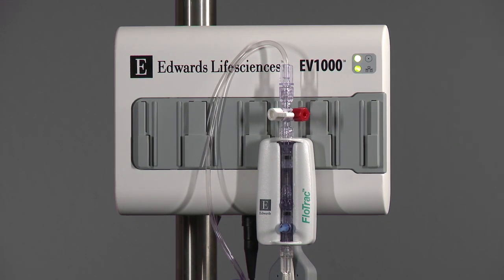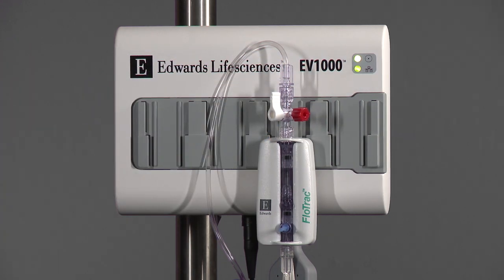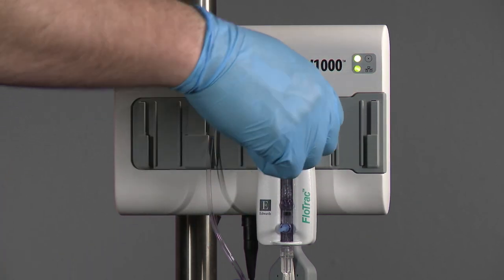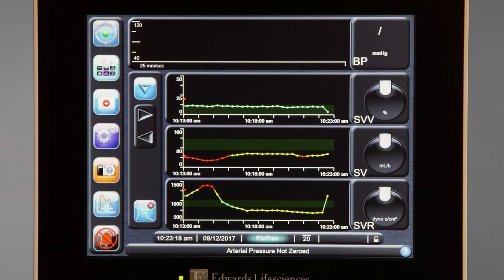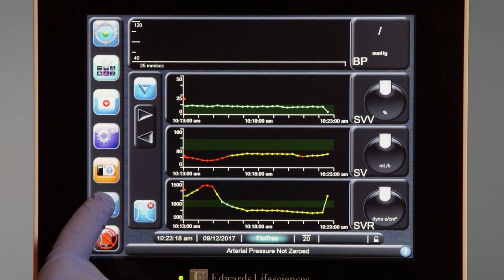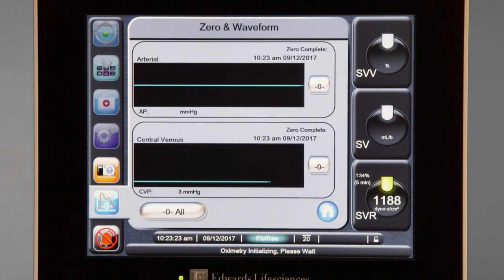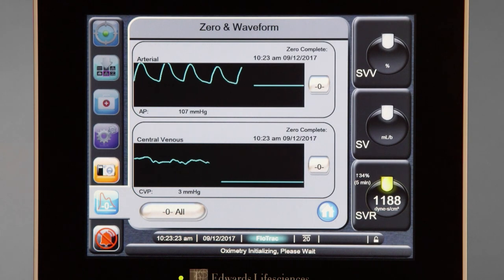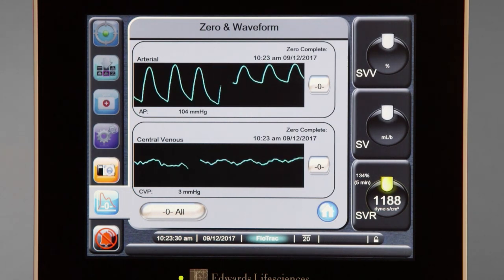Level the FlowTrack sensor to the patient's phlebostatic axis. Turn the reference stopcock of the FlowTrack sensor toward the pressure tubing and remove the non-vented cap. With the stopcock open to atmosphere, zero both the bedside monitor and the EV-1000 Clinical Platform. Confirm that the EV-1000 reads zero complete and the monitor reads zero millimeters mercury on the arterial channel.